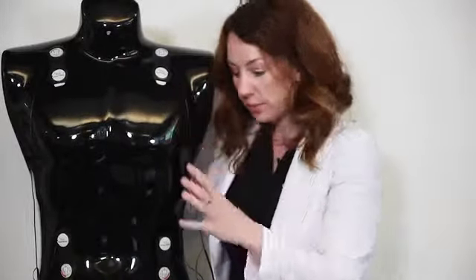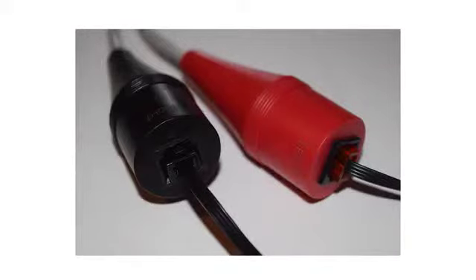So in summary, here we are. We have 2 sensors above the heart. We have 2 sensors below the heart. We have good, clean, dry, intact skin. And then we go ahead and plug the sensors into the patient cable, red to red, black to black, and then we can go ahead and hit start.